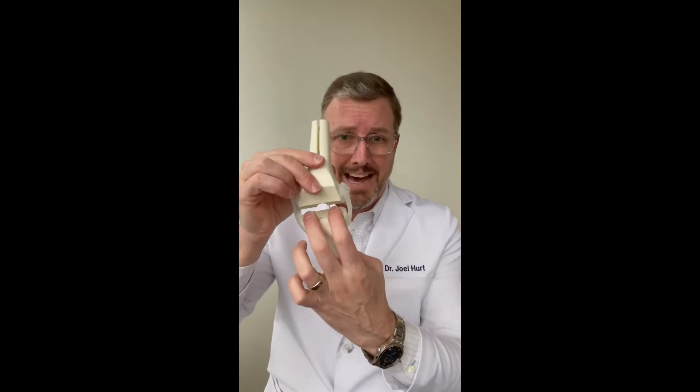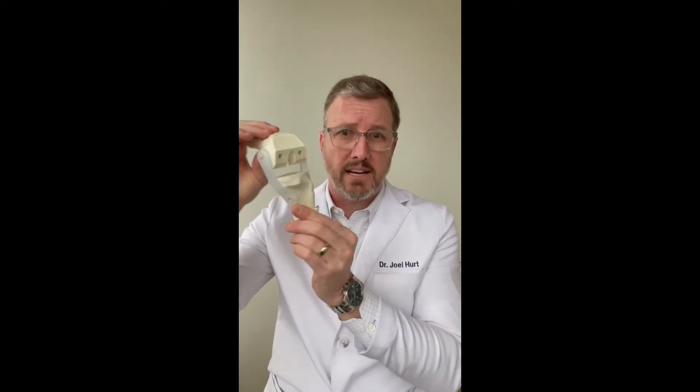We're creating what we call gaps. There's an extension gap — with the knee extended, there's a gap here — and there's a flexion gap. You can see the knee is flexed here and here. These gaps need to be rectangular and they need to be balanced.